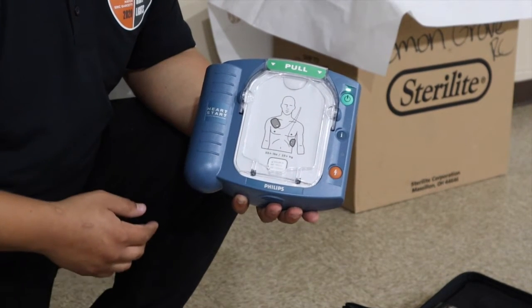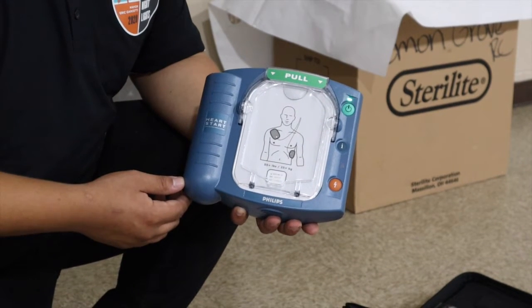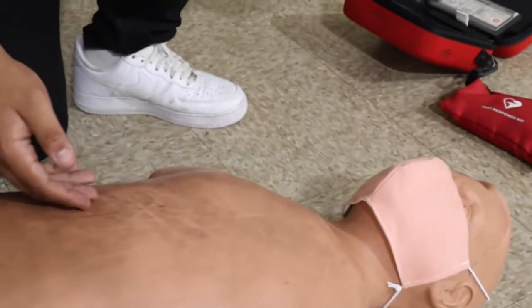Begin by removing all clothing from the patient's chest. Cut clothing if needed. So for video purposes, we're going to use a mannequin which already has the clothing removed.